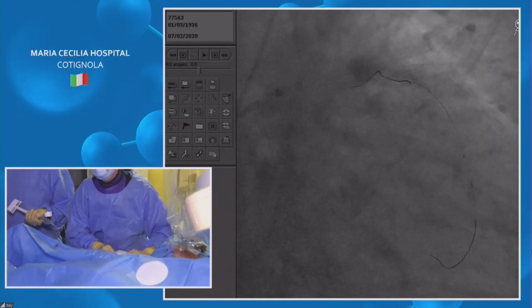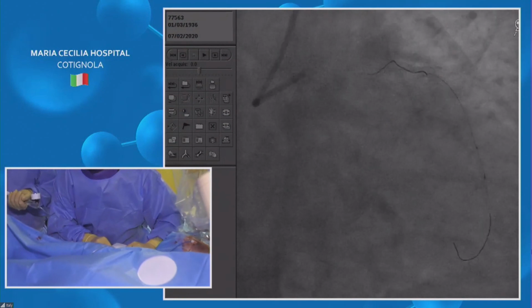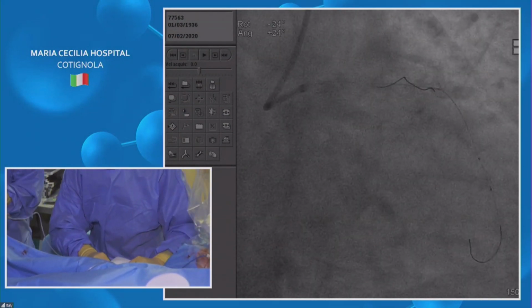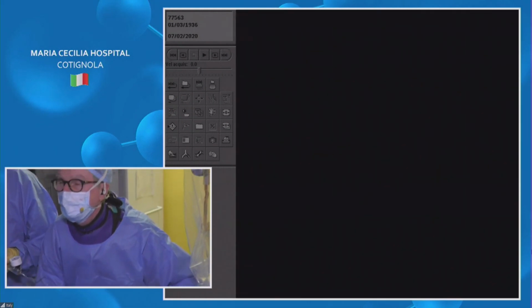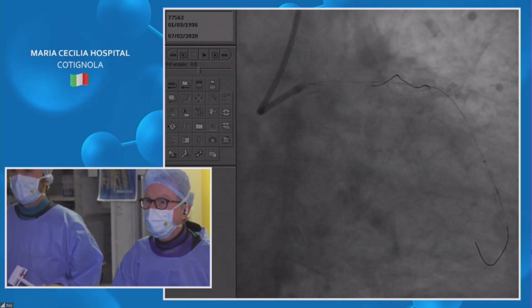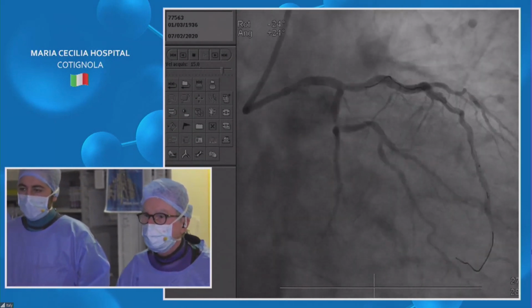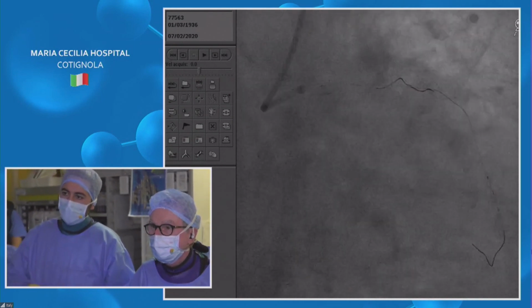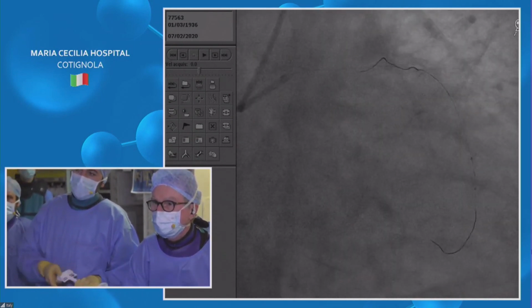Okay, small test. What do you think? It looks fine. Let's see if I can see the stent. No dye. See the no dye. I think we can go a little bit more distal. Yeah, just a tad. Okay, right there is where the branch comes off.